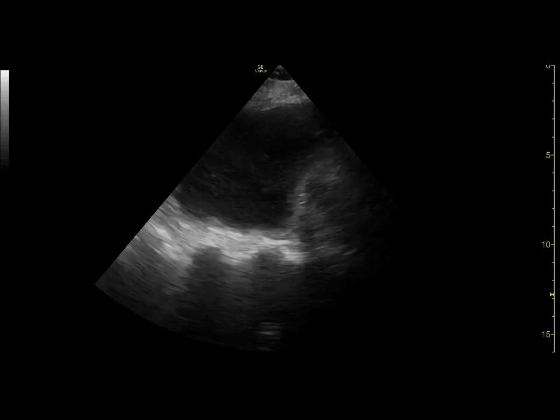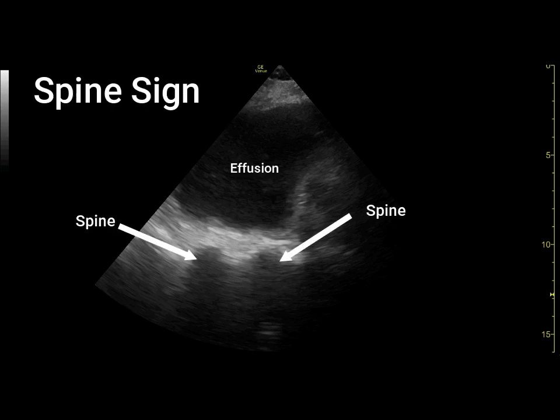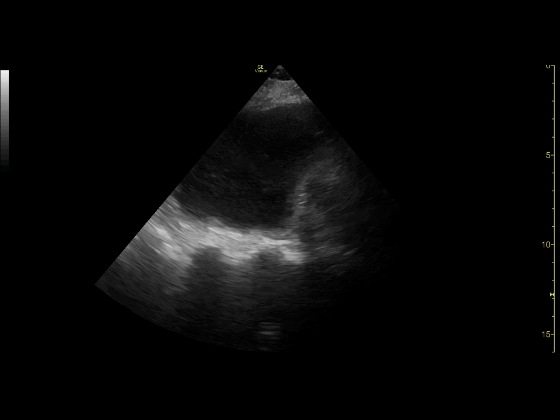In this view of the left lung, we can see the spine sign in a different patient with pleural effusion. The effusion acts as an acoustic window, effectively transmitting ultrasound waves to deeper structures like the spine, which would not ordinarily be seen in the absence of fluid.